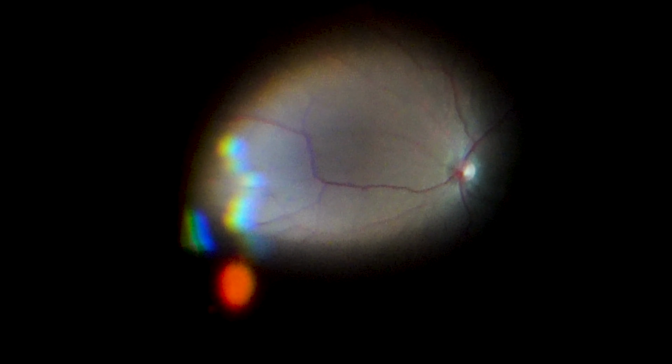You may notice this is superior peripheral laser, because the image is not re-inverted. There was retinal elevation and contraction at the retinal periphery. A barrier laser was carried out.